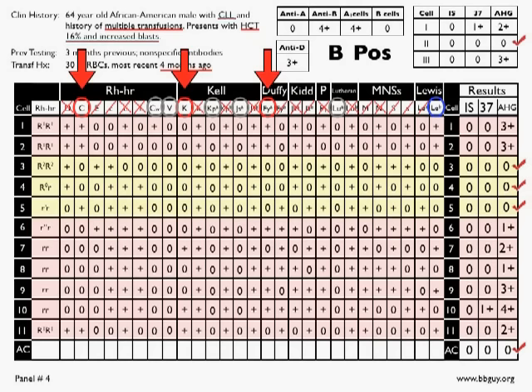You've got anti-Big C, which doesn't explain all the positive reactions, and in fact, has cell 5 where it's a single dose and with no reaction, so clearly there's a little bit of discrepancy there. You have anti-Big K, which clearly doesn't even come close to explaining all the positive reactions, and you have anti-Duffy A, which comes closer than the others, but still doesn't explain all the positive reactions. So clearly we have a situation where we have multiple IgG alloantibodies.